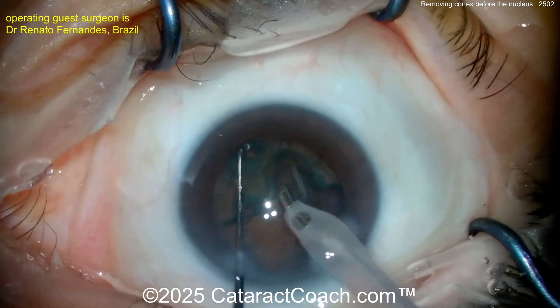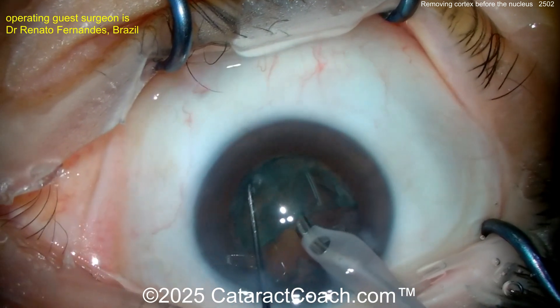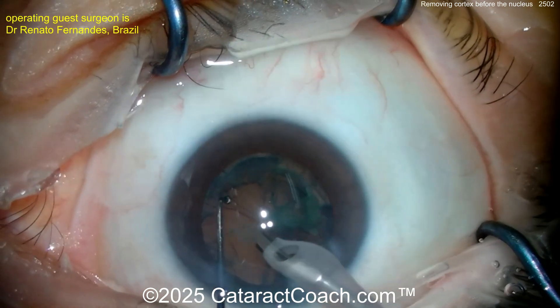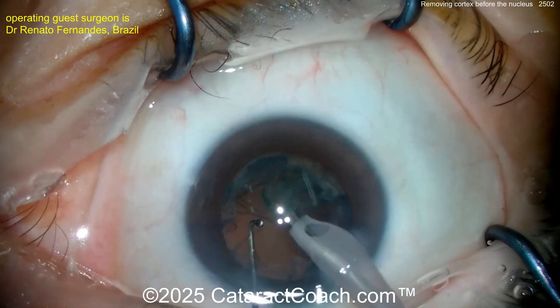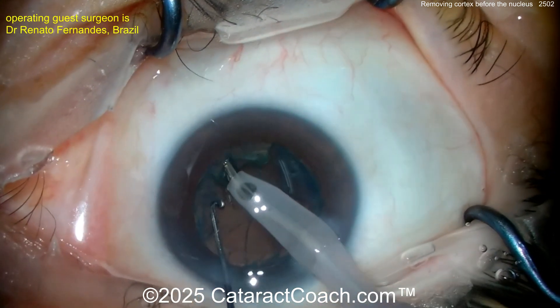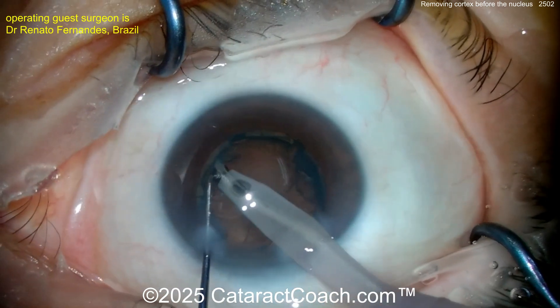Going behind here, removing this last bit of lens material — you don't need to chop anymore, just aspirate it down. I like the use of the chopper not only to chop but also as a second instrument to manipulate fragments, bring the quadrants up into the anterior chamber or pupil plane. Now removing this — there was a big epinuclear shell.